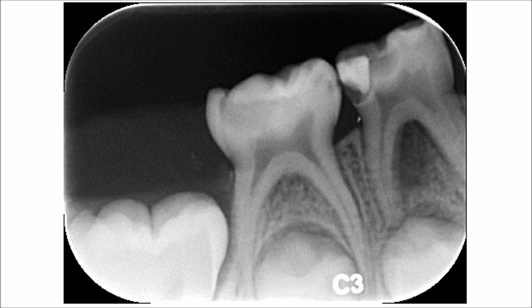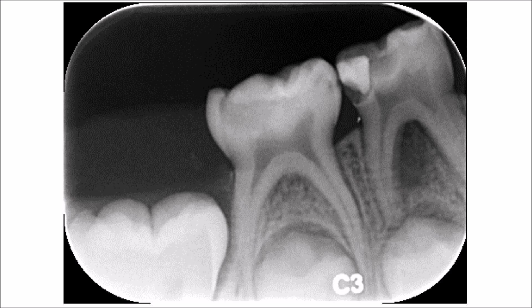On the same radiograph, on the first deciduous molar, you will see that there was an attempt to restore the tooth on the mesial surface, and the tooth has been affected by caries. Caries has affected the occlusal surface, showing the typical U-shaped appearance in the dentine. There is also a gingival recurrent caries located just underneath the filling.